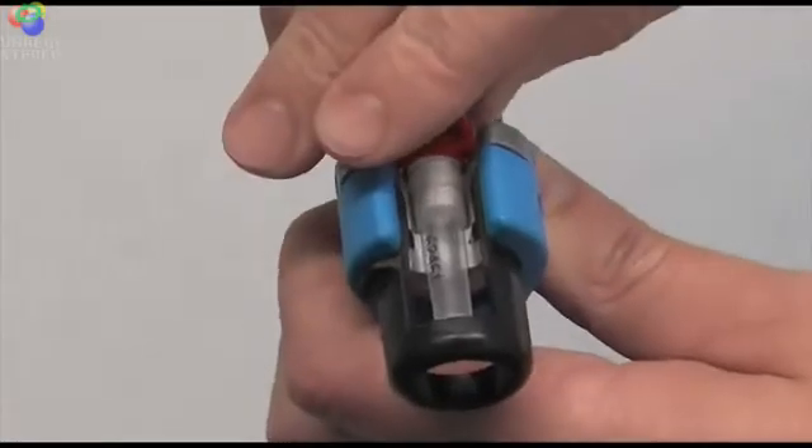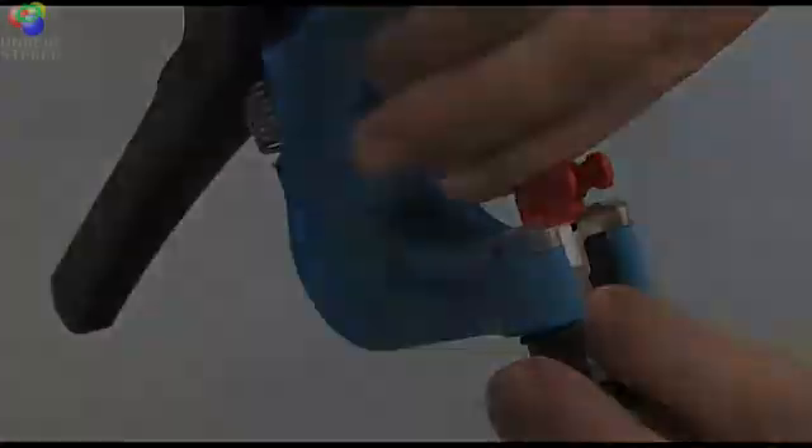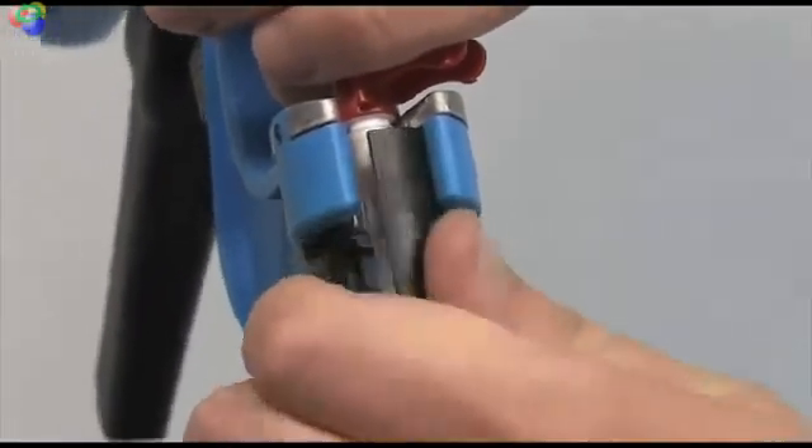The red clip part of the punch should sit flush on top of the surface of the applicator gun's metal plate as shown. Next, close the black tube retainer base by twisting it shut as shown.